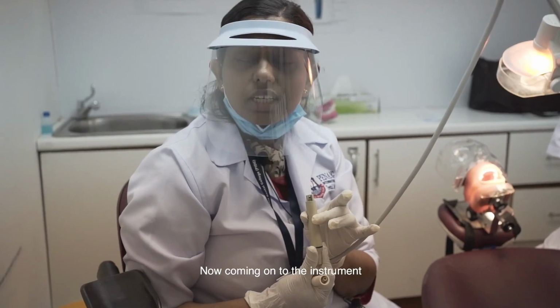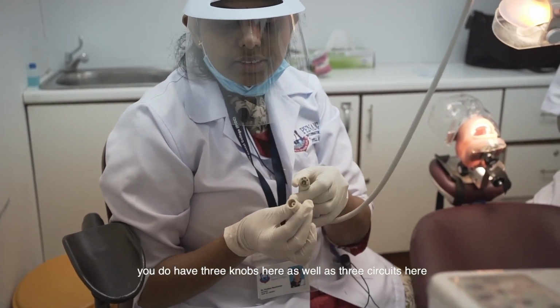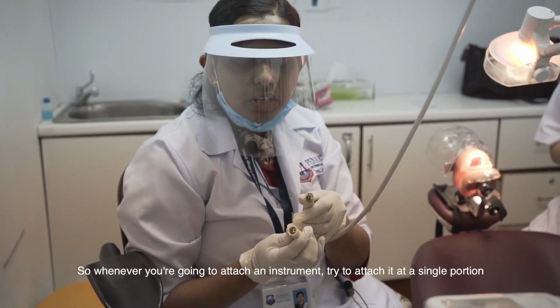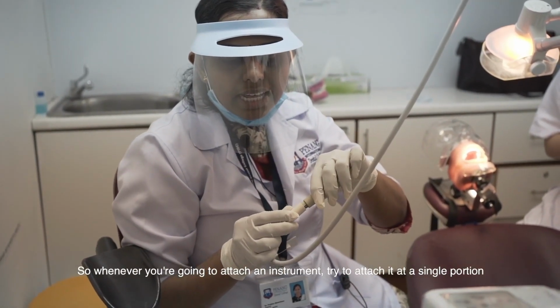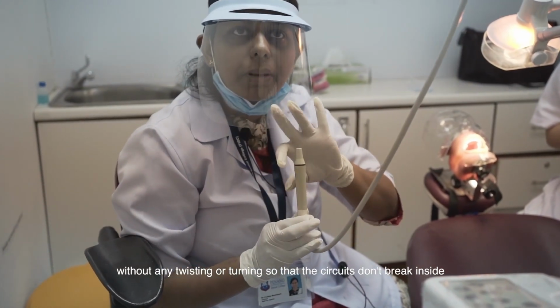Now coming on to the instrument, you do have 3 knobs here as well as 3 circuits here. Whenever you attach your instrument, attach it at a single position without any twisting or turning, so that the circuits don't break inside.